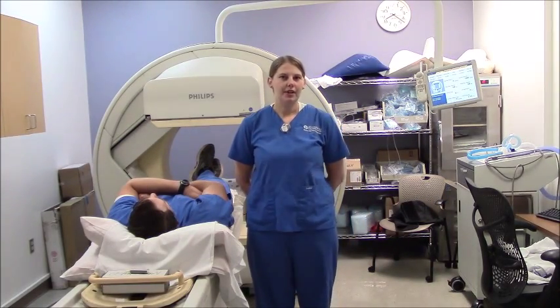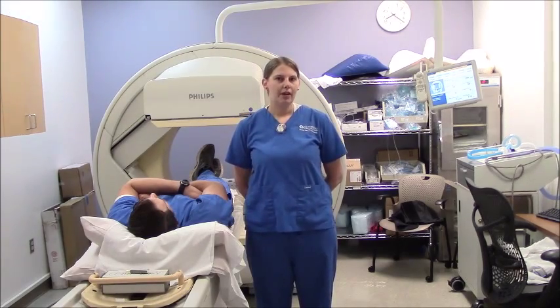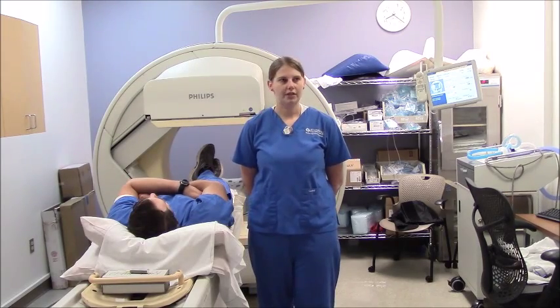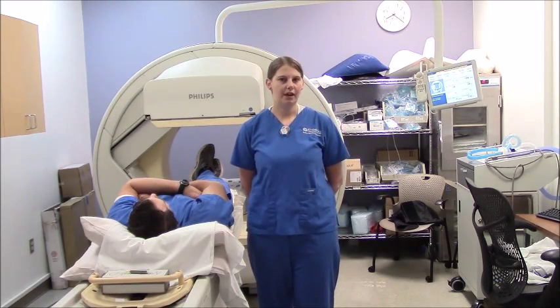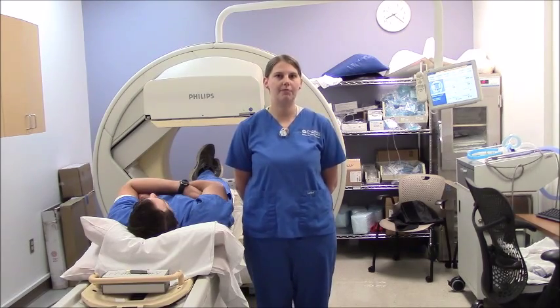I'm going to be demonstrating the perfusion part of a VQ test. What the perfusion part of the test does is it shows the blood flow in the lungs. This is compared to the ventilation portion of the test, which shows the airflow. The doctor looks at both of these images and compares them to see if there might be a pulmonary embolism, and if they think so, it also gives them an anatomic region of where the embolism might be.